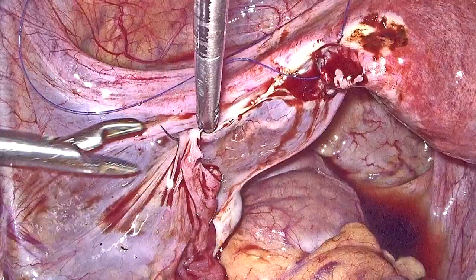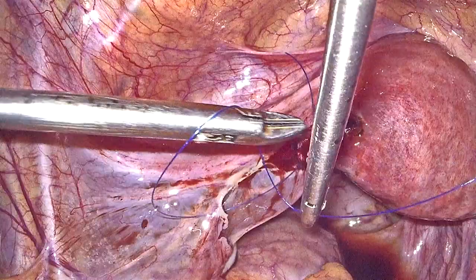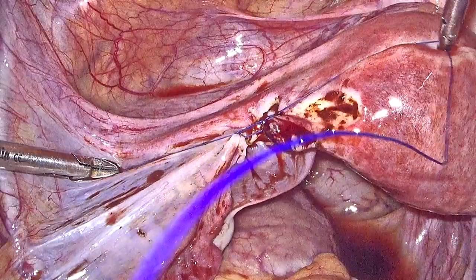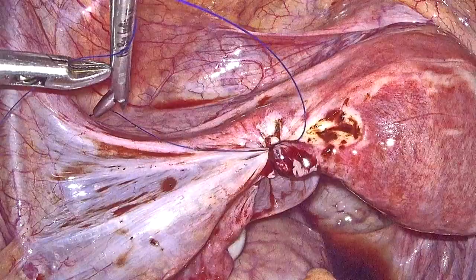Once the stumps are approximated, it is easier to carry on the rest of the suturing, which typically involves the suturing of the serosal as well as the muscularis layer of the fallopian tubes. One can also take sutures through the lumen, however we try to avoid suturing through the lumen because it might potentially increase the chance of having an ectopic pregnancy.